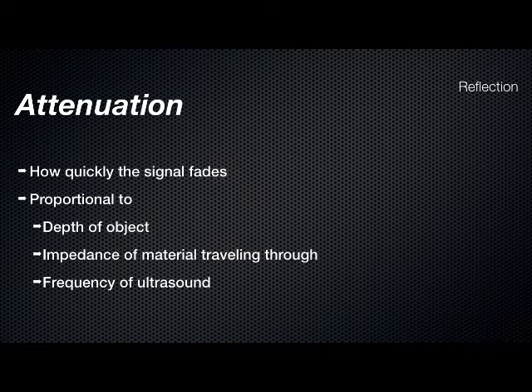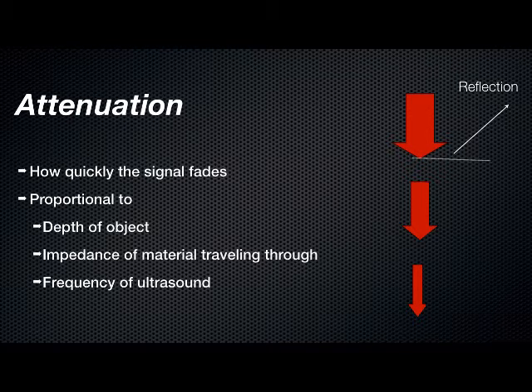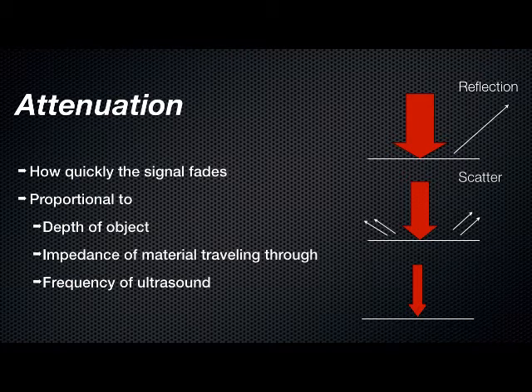Attenuation is basically what happens to the sound wave as it's going into the patient's body. So the farther it goes into the body, the more the signal degrades, and this is a piece of the physics, again, that has to do with some of it reflecting off of tissues, some of it sort of degrading as it goes into the tissues, and so that's going to impact your overall signal. The other thing is, because this is energy, it's going to be absorbed by the body, and so you won't get all of the sound waves back towards your probe.